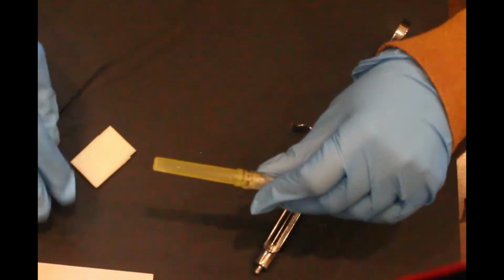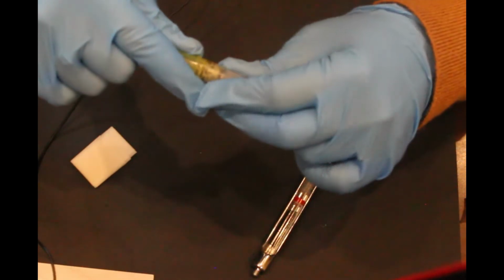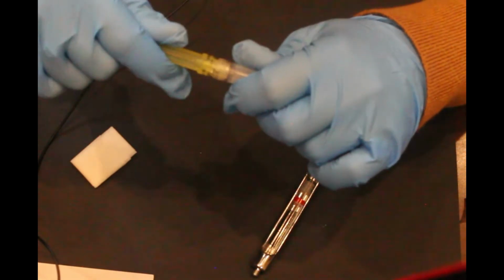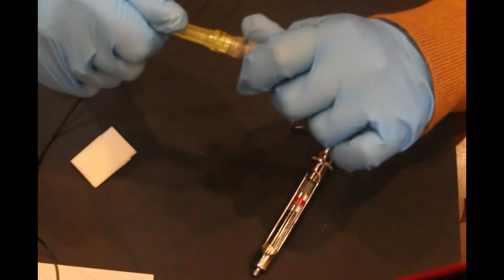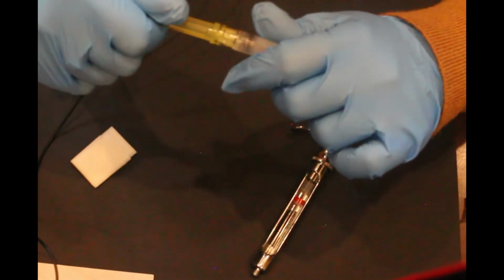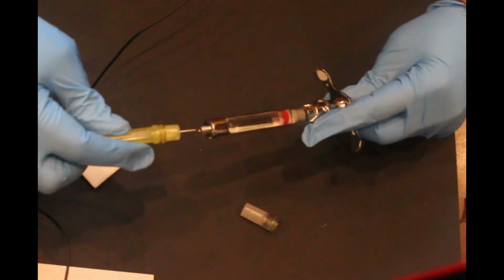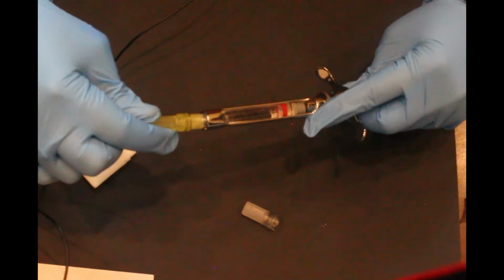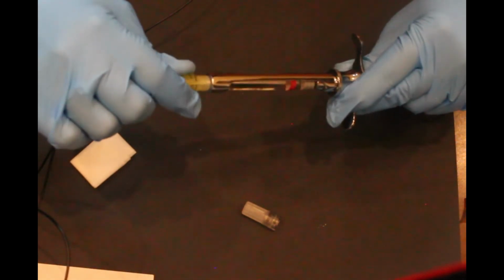Take your needle, break the seal, and gently unscrew the smaller part of the needle cap. Unscrew it till it becomes really loose for you to just drop it over the counter. You may use your syringe to help you with that. Then insert it and screw it back to the syringe really firmly till you cannot unscrew it any further.